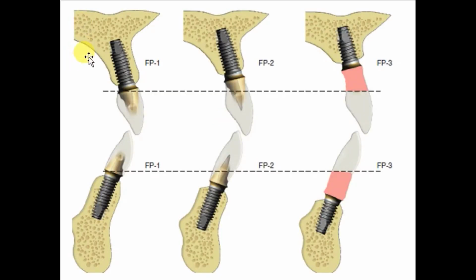As a summary, fixed restorations have 3 categories: FP1, FP2, and FP3. The restoration type is related to the contour of the restoration. FP1 is ideal, FP2 is hypercontoured, and FP3 replaces the gingival drape with pink porcelain or acrylic. The difference between FP2 and FP3 most often is related to the high maxillary lip position during smiling or the mandibular lip position during sibilant sounds of speech. FP2 and FP3 restorations often require more implant surface area support by increasing implant number or size or by adjusting design considerations.